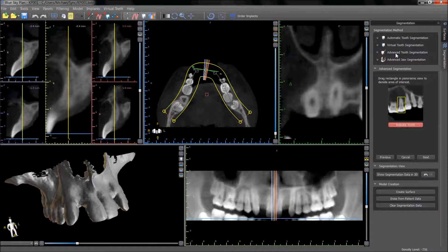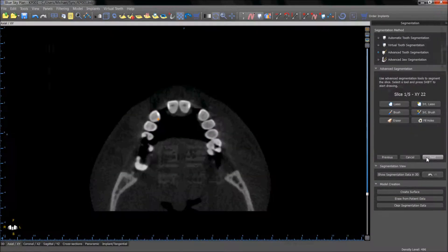Advanced tooth segmentation should be used for the most accurate segmentation process possible. Start by indicating the tooth in the panoramic view by drawing a rectangle around it. Pressing next will start a short wizard that the software will take us through to indicate the relevant tooth.